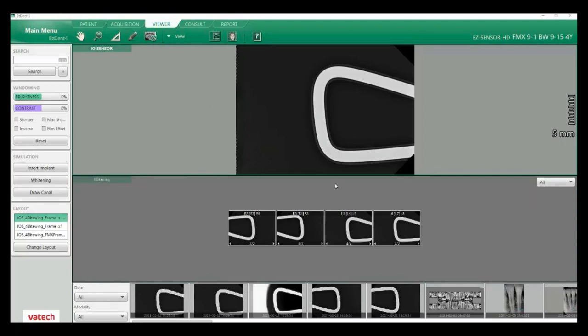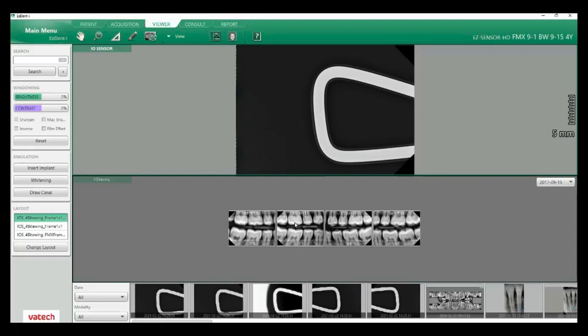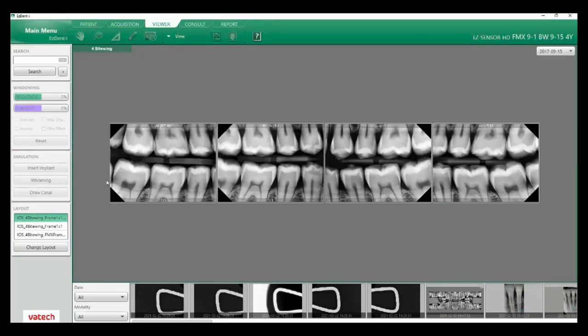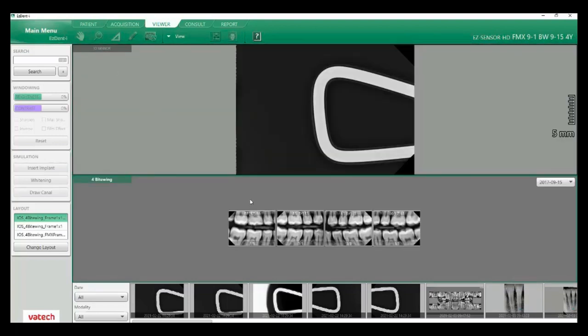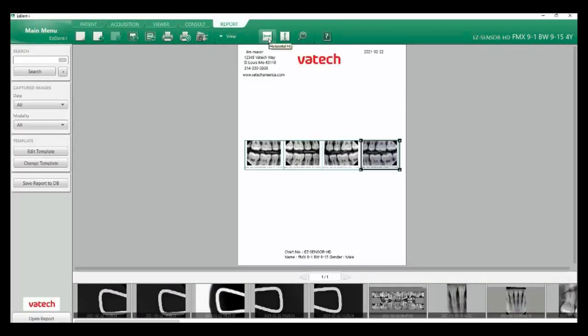Next let's look at sending our images to our report tab. I'm going to click here and go down to our original images from 9/15/2017 to see my four bite-wings. You can double-click on the upper left of each window to enlarge it to one window, and double-click again to go back to two windows. I'm going to double-click my four bite-wings to one window, go to my drop-down, and you can see I have my capture option. When I click on capture, this is how we send this to a report — hovering over this tells us 'send to reports,' and that adds this to our report tab.